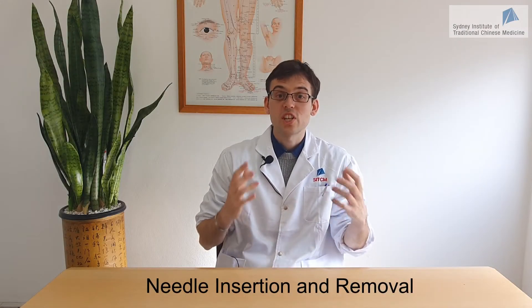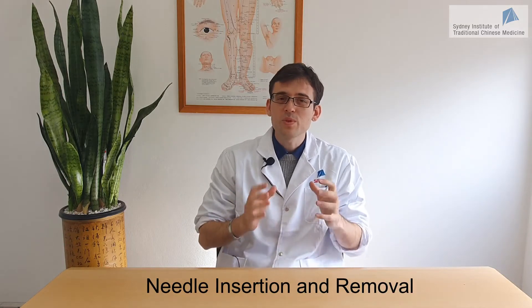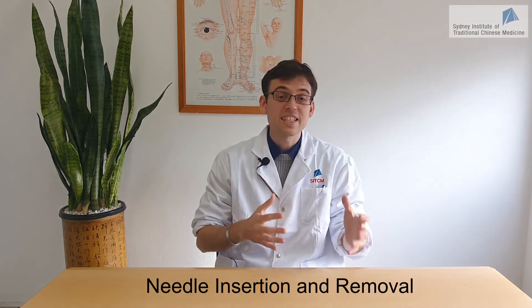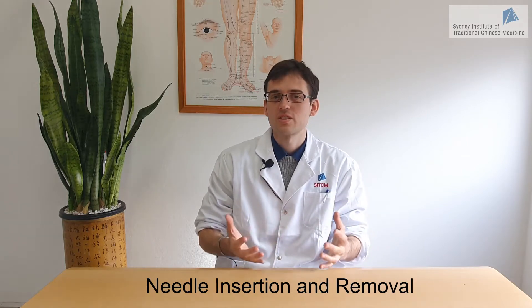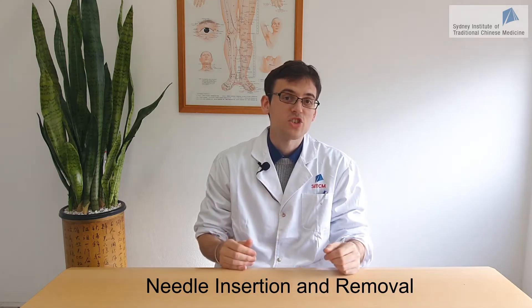Needle insertion can be very challenging for every beginner acupuncturist, and you want to make sure you get everything right. In this video, we will go through all the basic acupuncture techniques, including how to handle the needle, how to insert a needle, how to remove the needle, and we'll also share with you some tips for painless needle insertion.